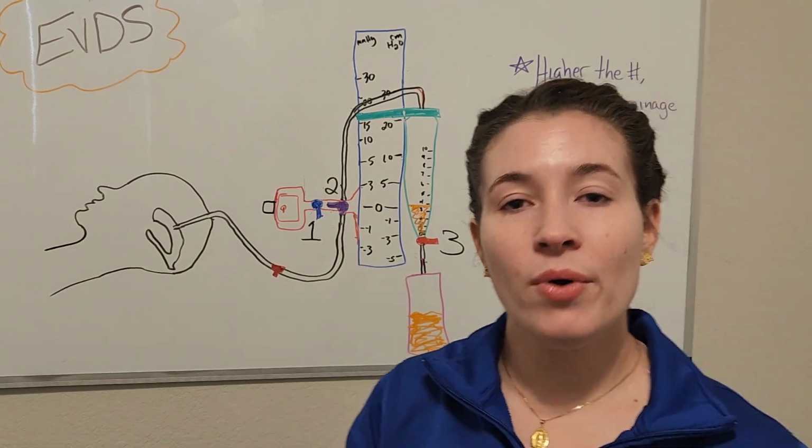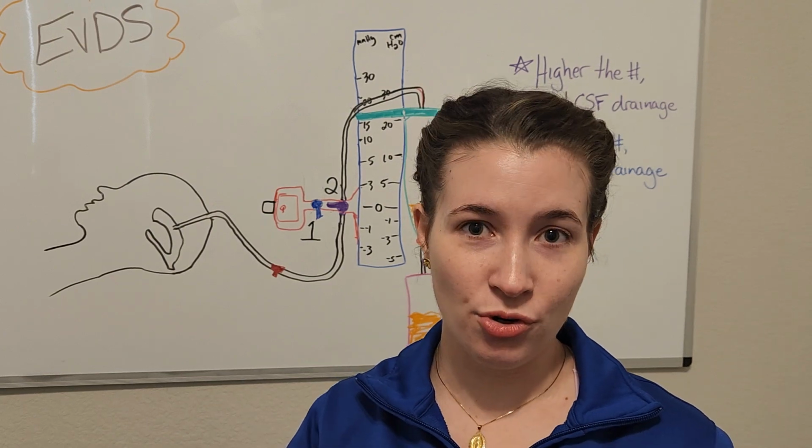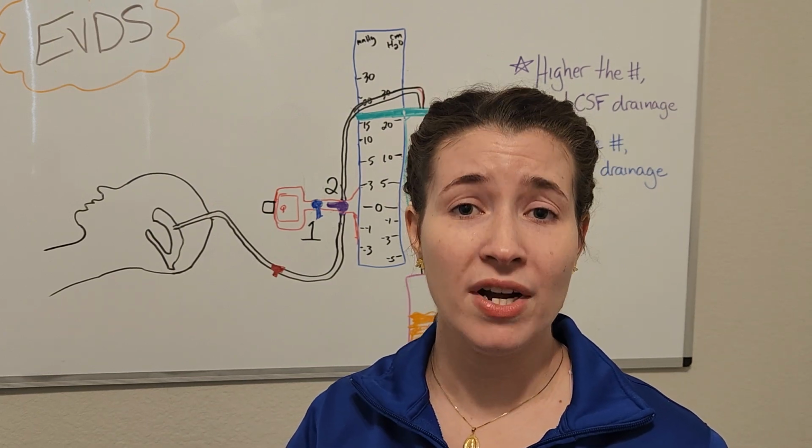So remember, always check your unit policies and your provider's orders so that you know what to do with your EVD drain.